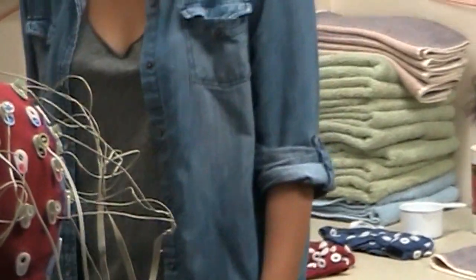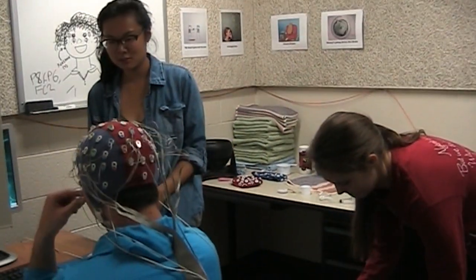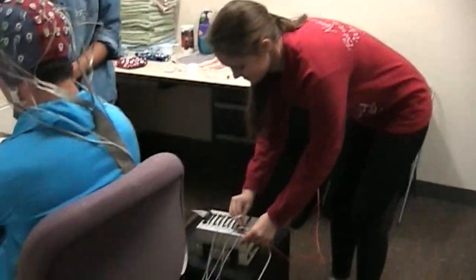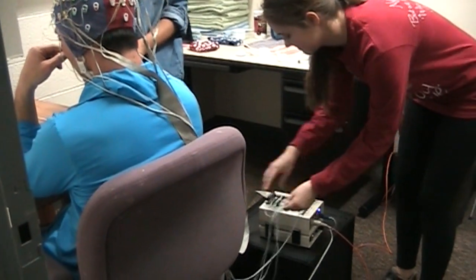So we're just going to unplug the electrodes from the box, and if you want to peel off your facial electrodes, I don't like doing this part because it reminds me of ripping out a band-aid.